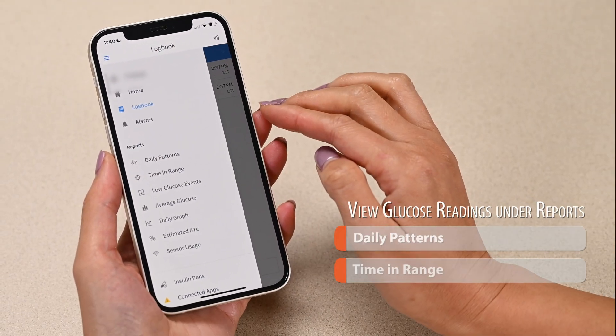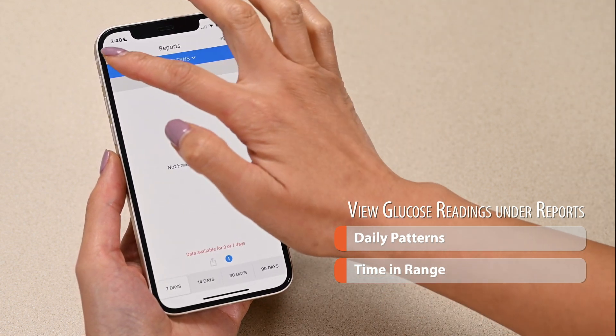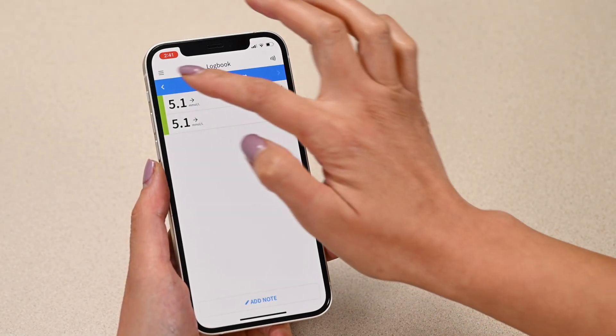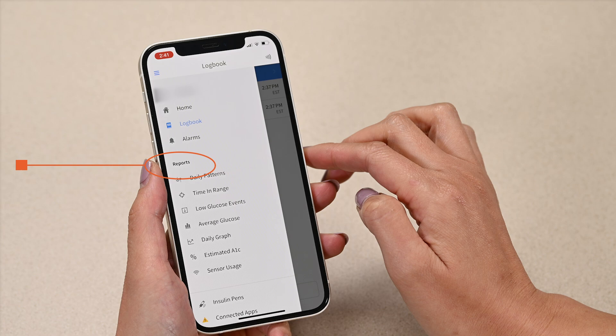You can also look at your glucose readings by viewing different reports such as daily patterns and time in range. Find these reports by tapping the menu button. The different options are listed under the reports heading.